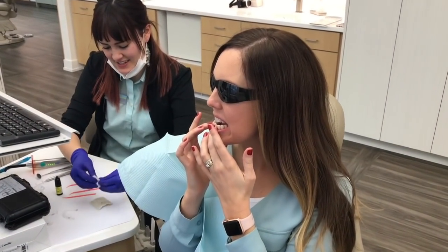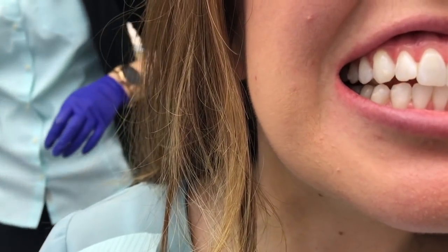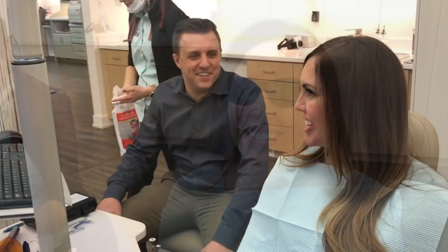They'll repeat that process on all the teeth that are going to have attachments. I know — can you see them? They're the same color as my teeth. It's weird to run your tongue over your teeth because it's not smooth anymore. I feel like there's some little bumps. That is crazy!